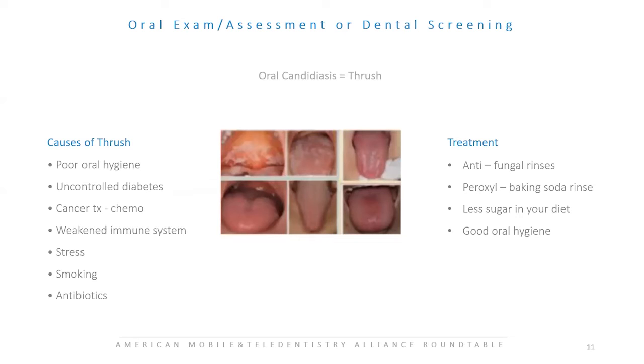And because the primary part of our population is in long-term care and they have a lot of different health issues, we're looking for a lot of different abnormal conditions, and thrush seems to be very predominant in the senior population. And I feel like the TelScope video just is going to give us a better visual of what's going on in the patient's mouth.